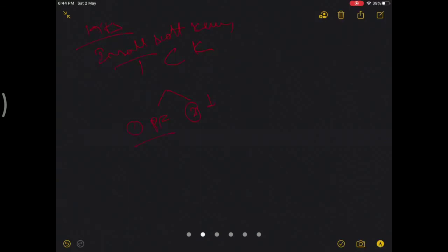Since they took out both the cruciates, there was nothing to get the femoral rollback mechanism back. So the maximum flexion attained was around 90 to 95 degrees. Then came the importance of the PCL, which is required for the rollback, and then came the duopatellar implant design.